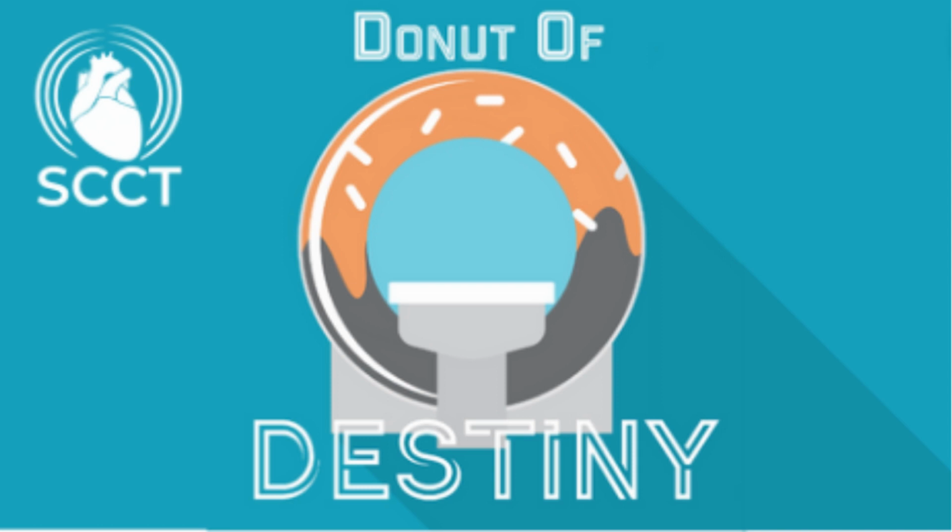I think this difference we're seeing is a consequence of the FFRCT technique itself. As we discussed in our previous episode, the FFRCT value, that number, is dependent on the myocardial mass supplied by an individual vessel. In most patients, the LAD supplies a large amount of myocardial mass, larger than the other vessels for sure. So, LAD stenoses often affect more myocardium and are, therefore, more likely to be positive on FFRCT.